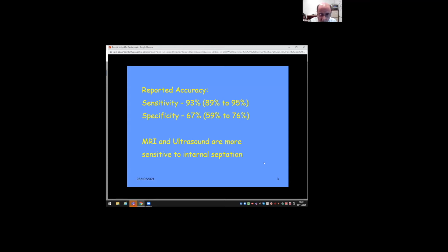Now, there's no one, I'm sure, listening to me, that would in any way disagree that when you have a fluid-containing structure, like a pleural effusion, like a cyst, like anything else that contains fluid, there's no way that CT is as sensitive to the internal contents as MRI or ultrasound is.